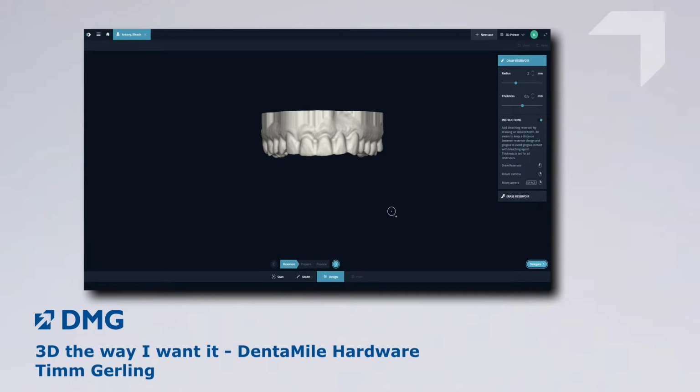For the reservoir design, we find different tools. So one tool is the drawing tool to draw a reservoir, and then we find also an erasing tool to erase reservoirs in spaces where we actually do not want to have it. So first step is I draw a reservoir. I can give it a defined radius of 2 millimeters, for example, and I can also select the thickness of the reservoir from 0 millimeters, so means no reservoir will be required, or up to 1 millimeter space for the bleaching reservoir. The default value is 0.5, and this is what I select for this design.